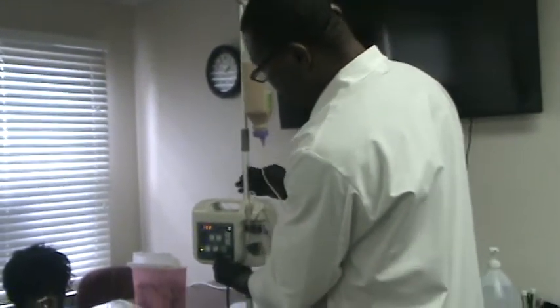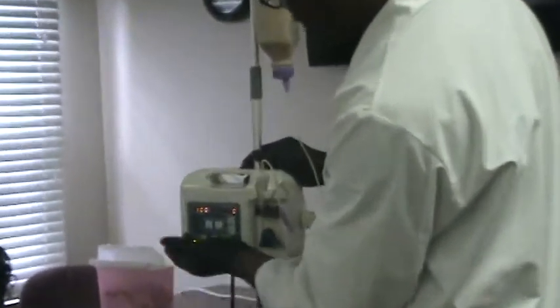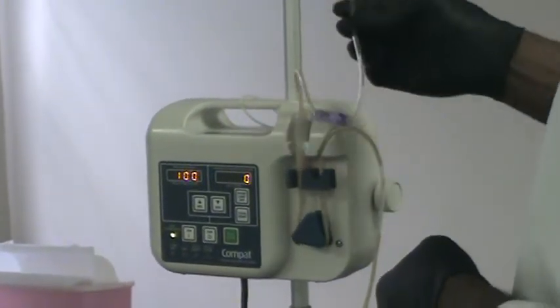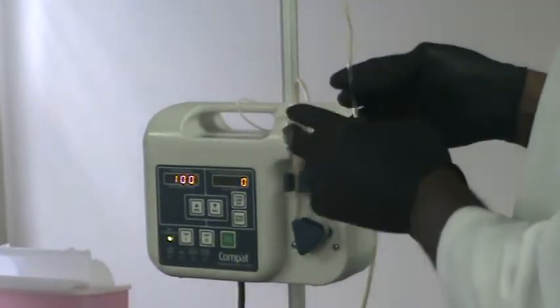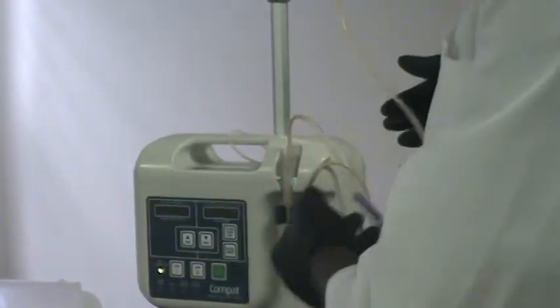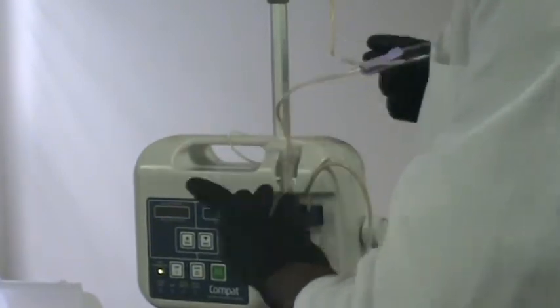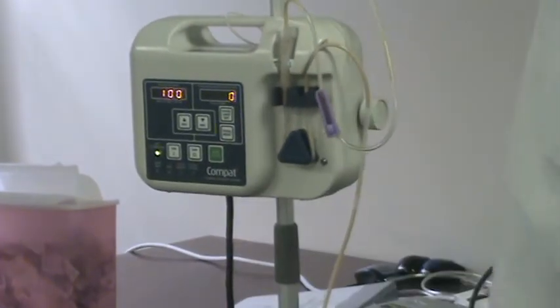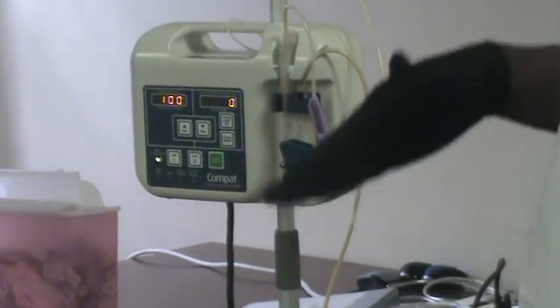Alright, so you just turn this on to run the feeding. So it will start going, it will start flowing. It might not flow because it's sticking. It's showing error because the flow is not going to flow. But usually, it will just keep going and going.